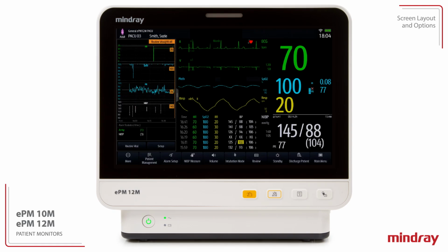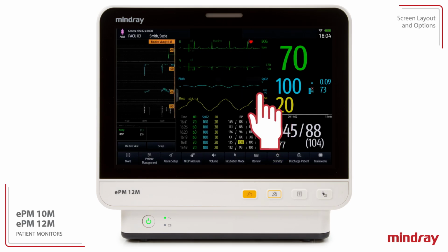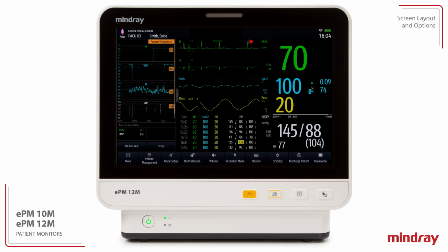The Mini Trend screen may be expanded to view longer trends. Select the button on the right side of the Mini Trend screen to expand the screen. Select the same button to contract the view. Return to the normal screen by using the multi-gesture swipe feature.